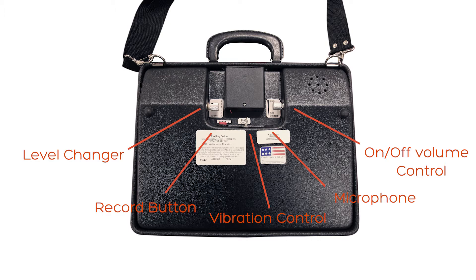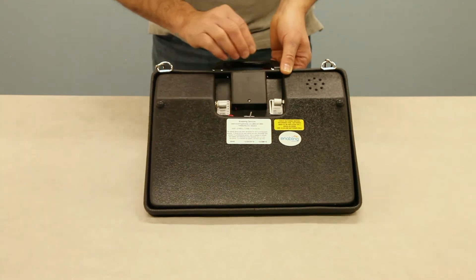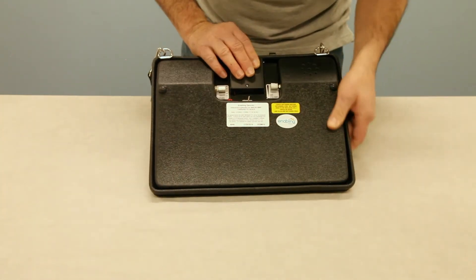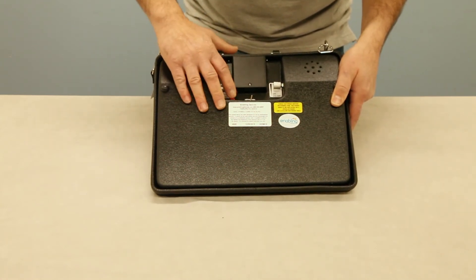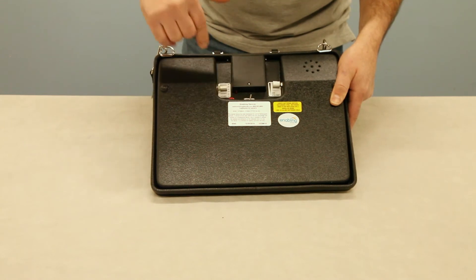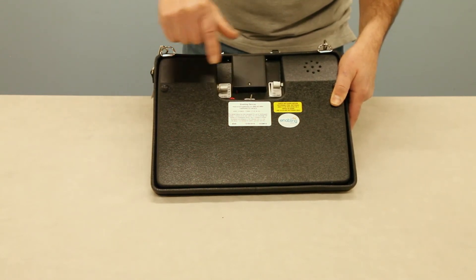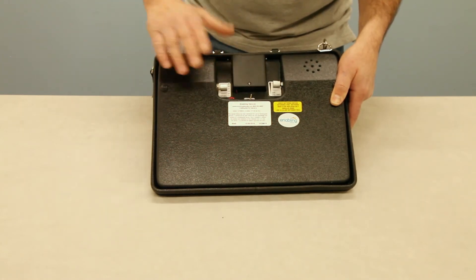Let me demonstrate how you make a recording. Turn on the device and put the volume up. When recording — we have it set to level one — depress the record button first and hold it, then while holding the record button down, depress the location on the front of the device that you want to record for. Speak into the microphone in your normal tone of voice, about six to eight inches away.